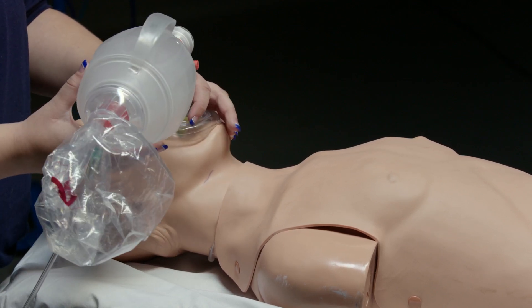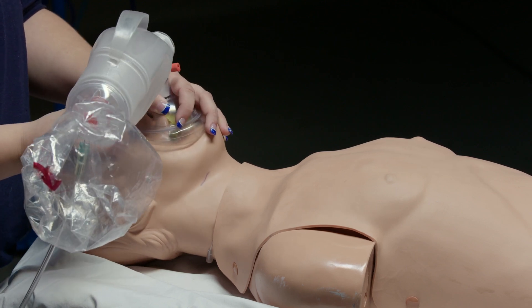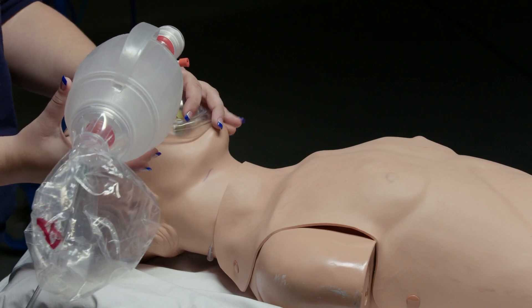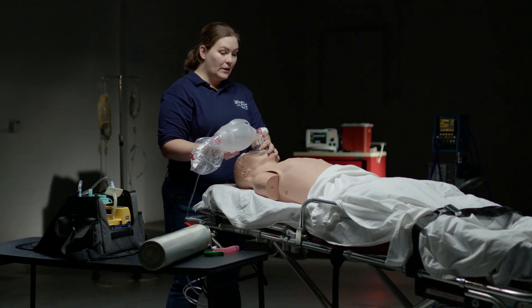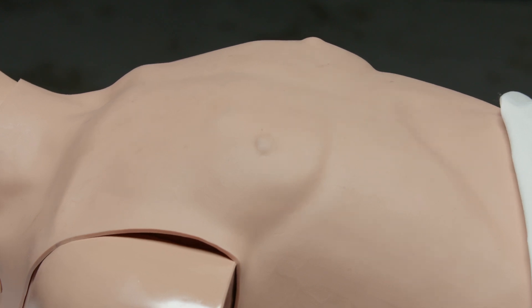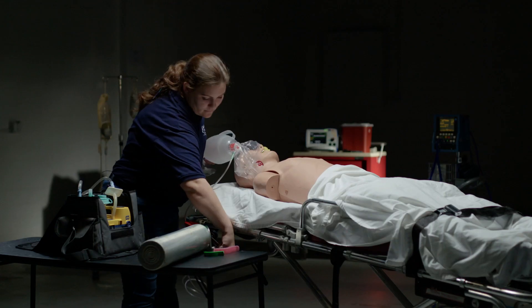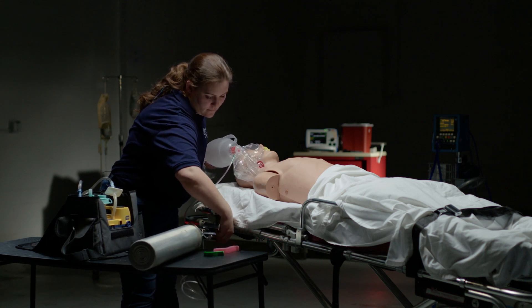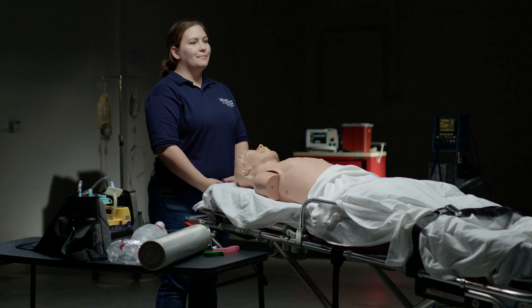How would you know if you're delivering the appropriate volumes with each ventilation? Equal and bilateral chest rise. I am now done with the station.